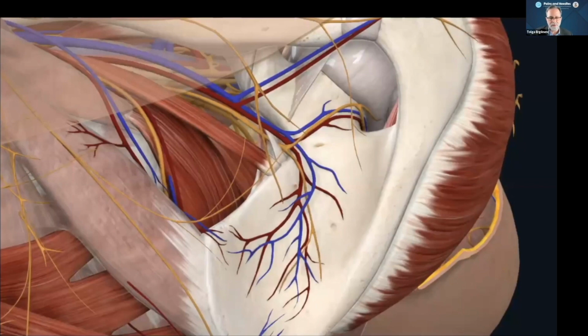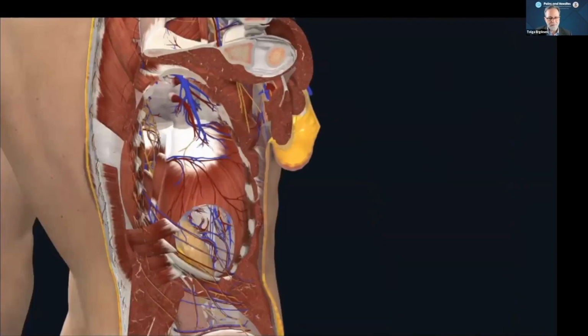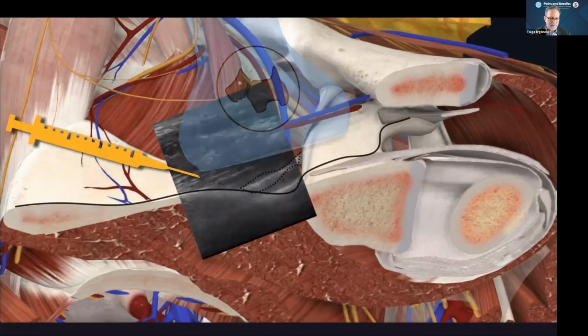This is the supraspinatus fossa as well. You can see the artery, vein, and the nerve. Okay, this is a great picture, and this is a great sonogram of the suprascapular fossa. In my daily practice, I usually use this approach, the medial to lateral in plane approach for the diagnostic suprascapular nerve block or radiofrequency ablation of the suprascapular nerve.